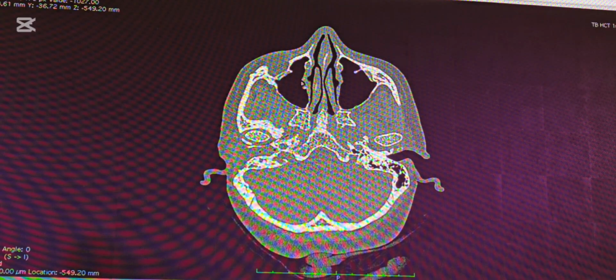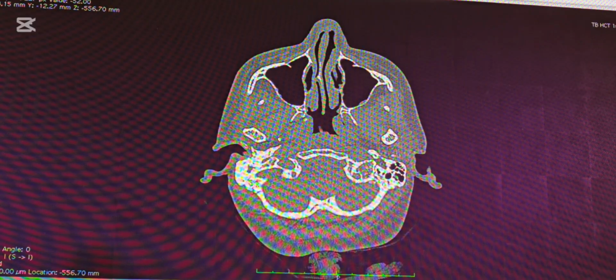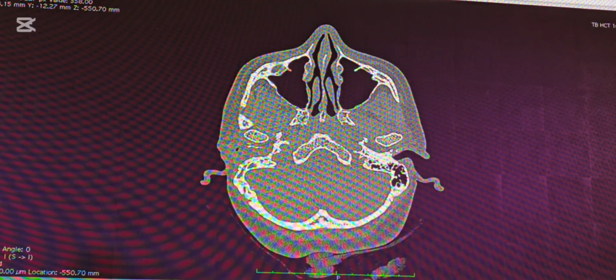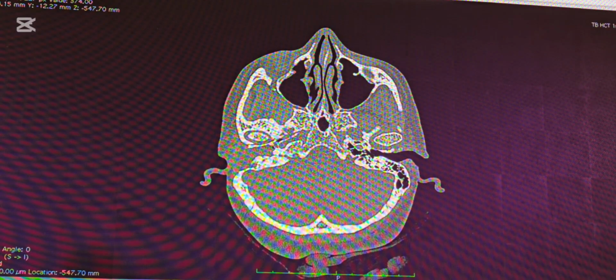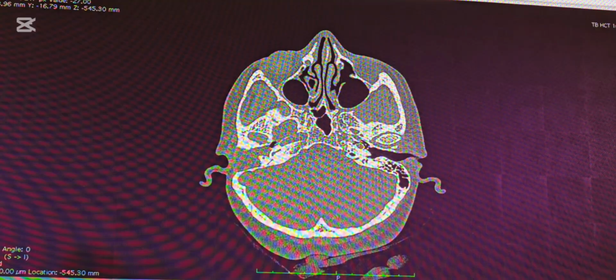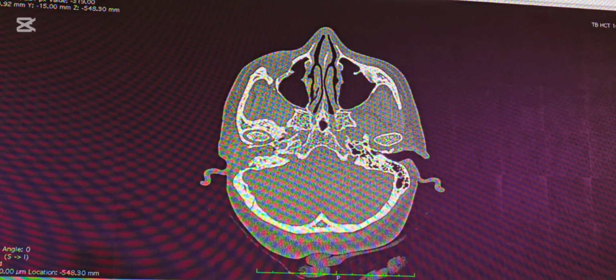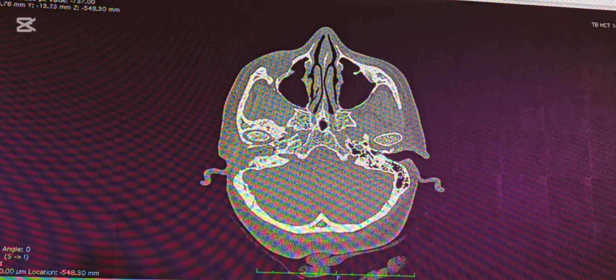So this is the maxillary sinus in axial view. So what is this structure? Lateral pterygoid plate and medial pterygoid plate, and coming superior, can you see that? So that's the sphenopalatine foramen region, which opens up into the nasal cavity.